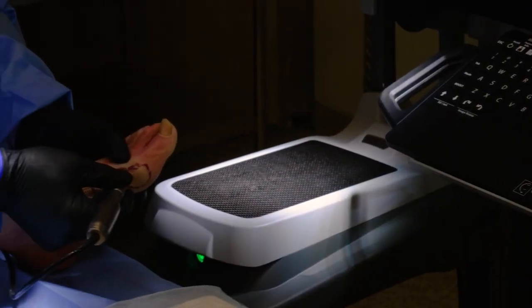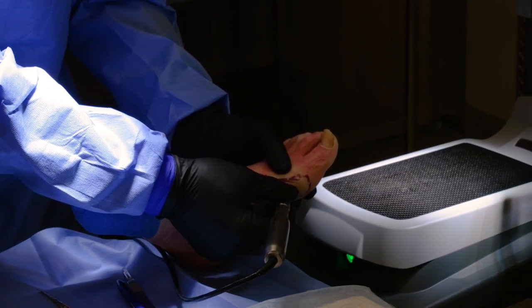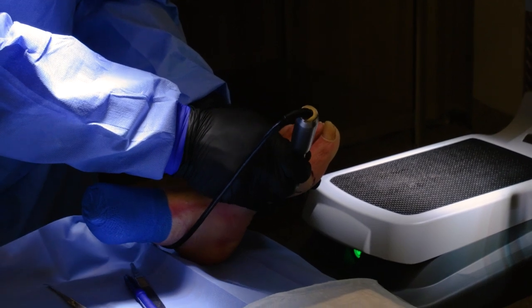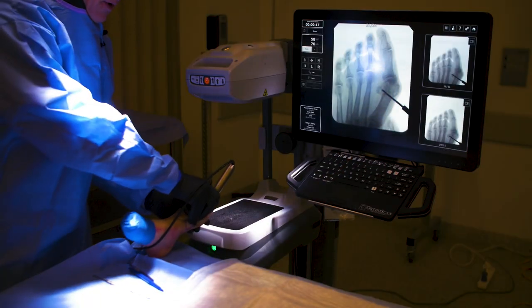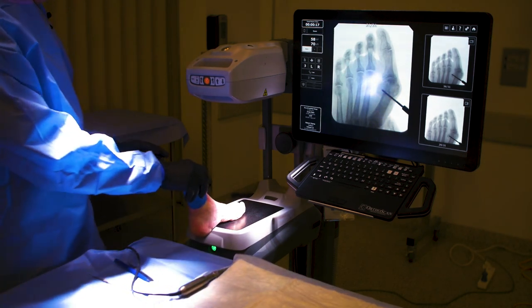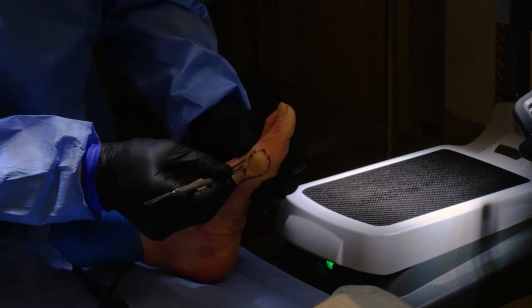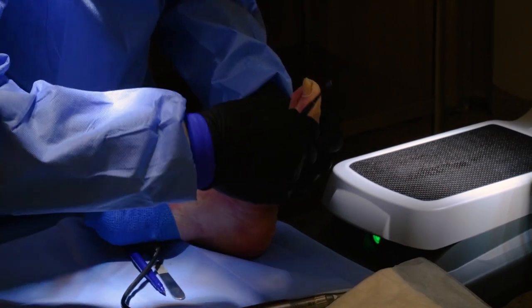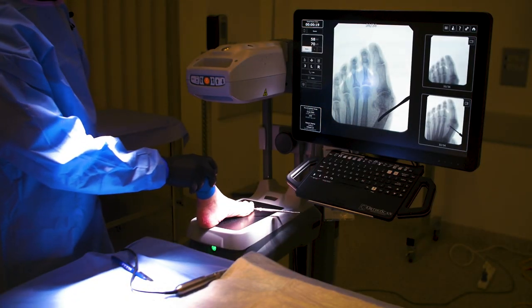For the plantar or chevron cut, I take my hand and rotate it — turn it on, go through, come over, and lay my hand down right on top of the big toe. I should be through now, laid down parallel. I'll take a quick look. I could use a freer elevator or a translator — I need to feel that it's through. Even if I'm going to use the guide, I want to mobilize the head a little bit. And there you go — you can see the head is already moving over.